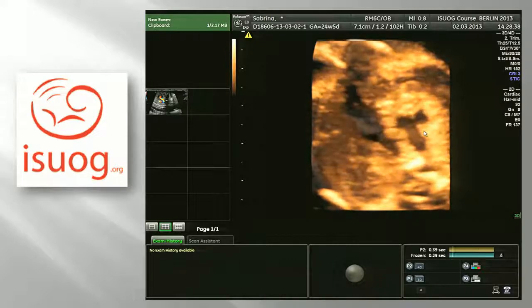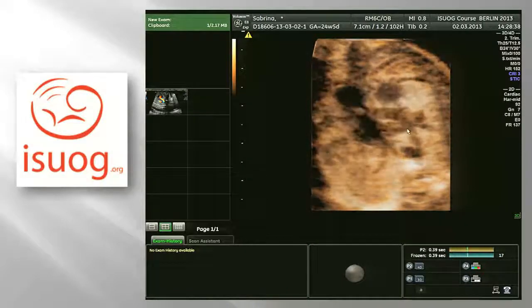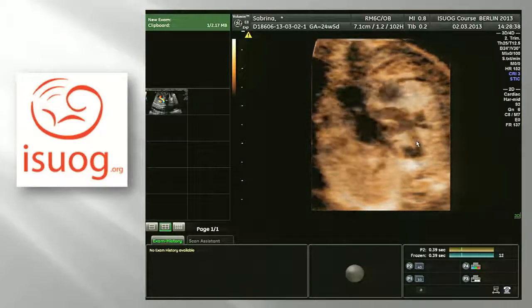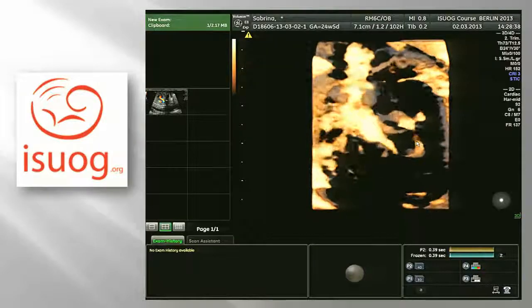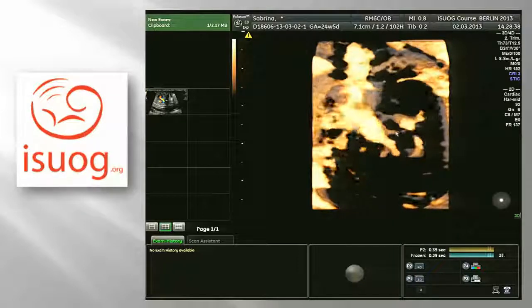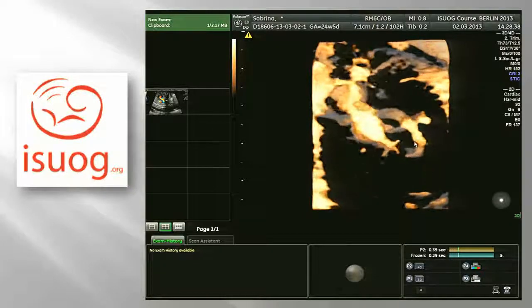And at the end, maybe you go to minimum mode, and you have information about the vessels, and you see the ductal arch and the aortic arch. Can you invert it, Kai, please? Yes. You see the pulmonary trunk. This is a raw image with the ductal arch, the right pulmonary artery, and the aortic arch stays on the right side.